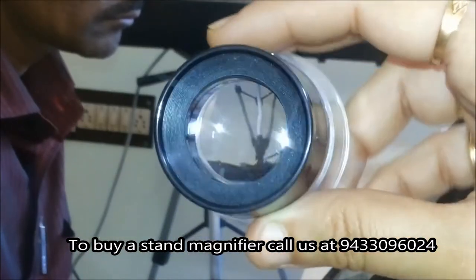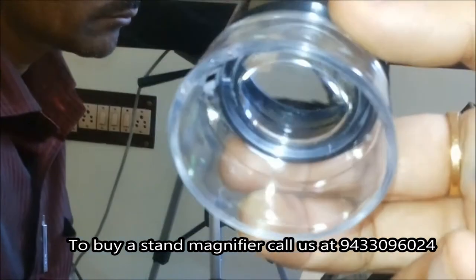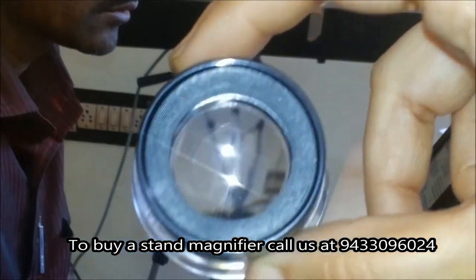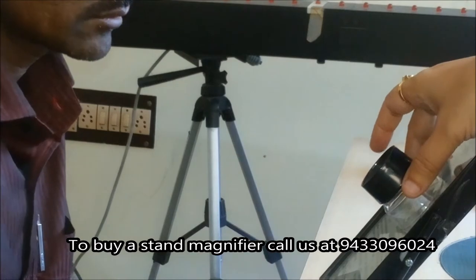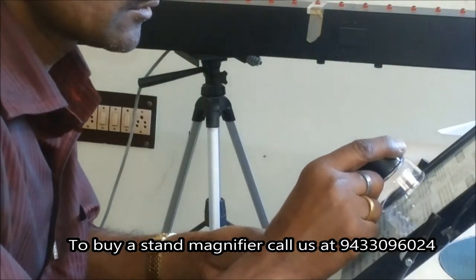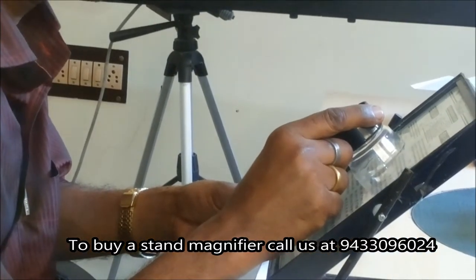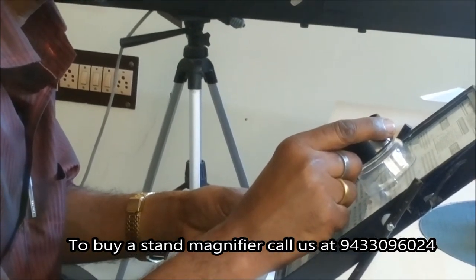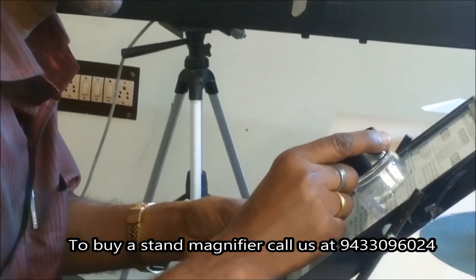One more magnifier having 5x magnification. So it is not in the shape of a C cut, it is just a rounded one made of acrylic. So with this, also the patient will keep it on the paper. So the patient has to keep it on the paper and slowly slide down. The patient will slide it on the paper and will read the text.